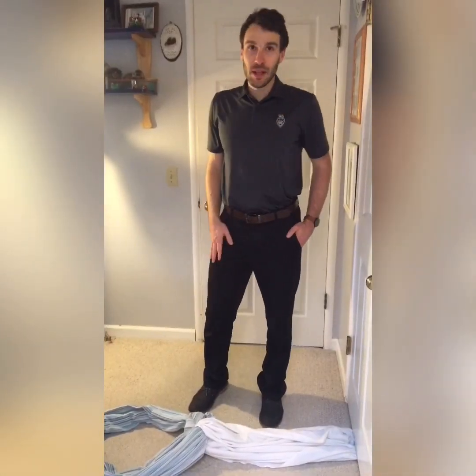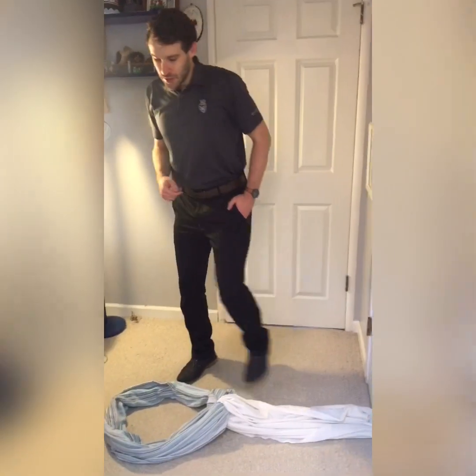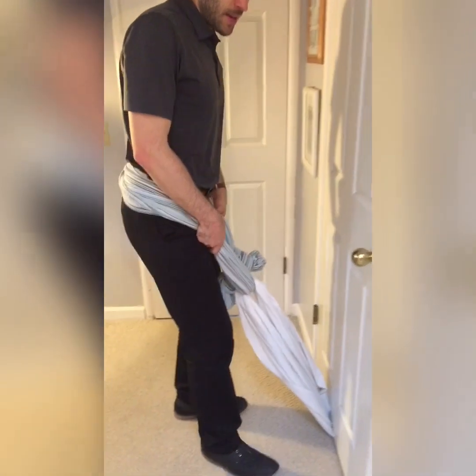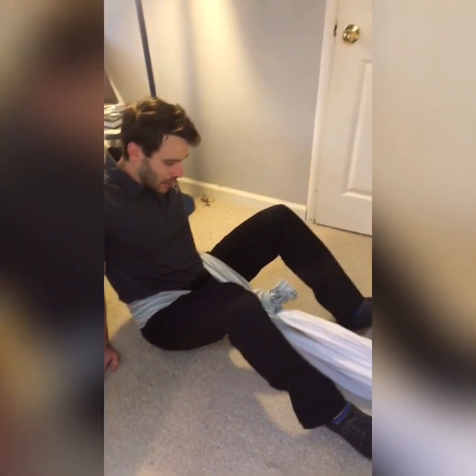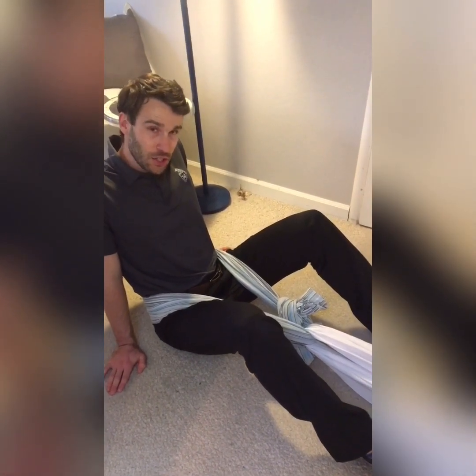Now that we've set up the lumbar traction system, we're going to show you how to use it. First thing you're going to do is step into the loop created by the second bed sheet and slide it up to the area right at the lower lumbar spine. From there, you're going to step back from the door and carefully lower yourself down to the floor. Here you should start to feel a little bit of traction, but if you need a little bit more traction in your low back, just simply back up until you feel the adequate traction that you need.